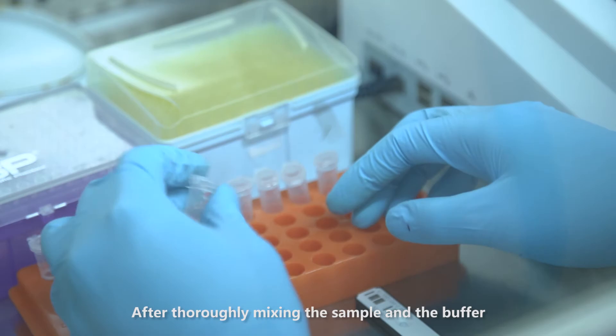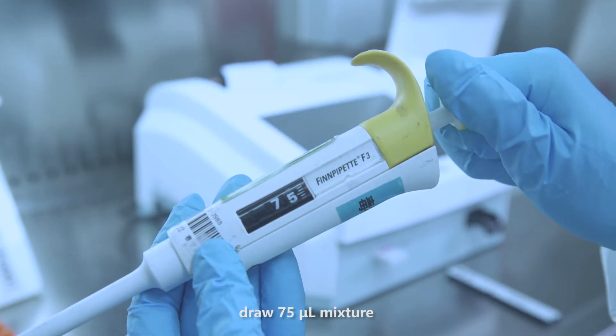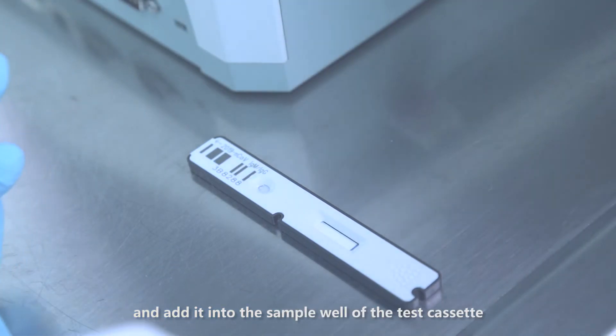After roughly mixing the sample and the buffer, draw 75 microliters of mixture and add it into the sample well of the test cassette.